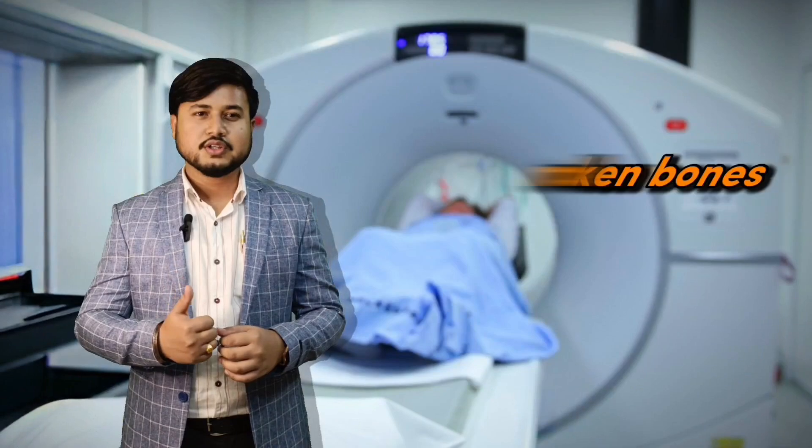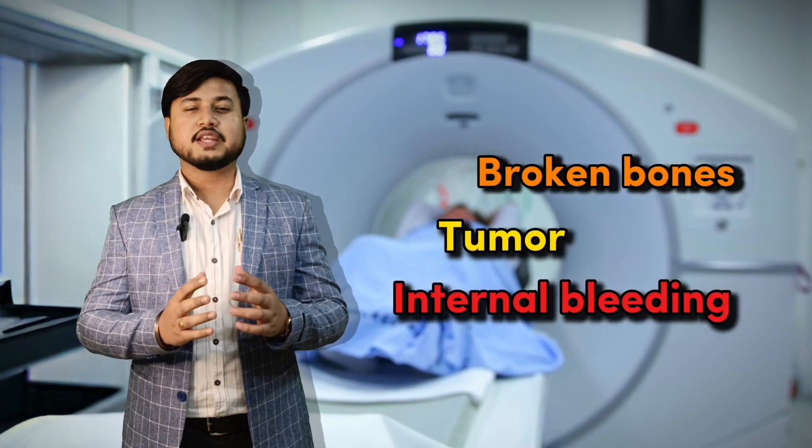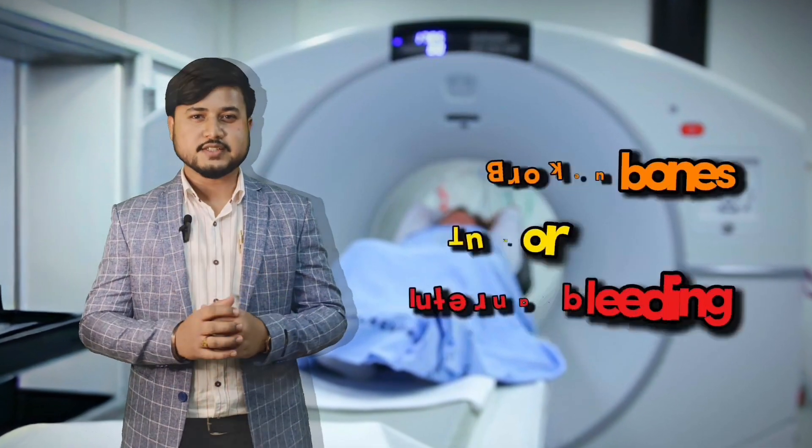CT scans are useful for diagnosing a wide range of conditions, from broken bones and tumors to even internal bleeding. They are fast, painless, and provide a level of detail that is hard to match with other imaging modalities.